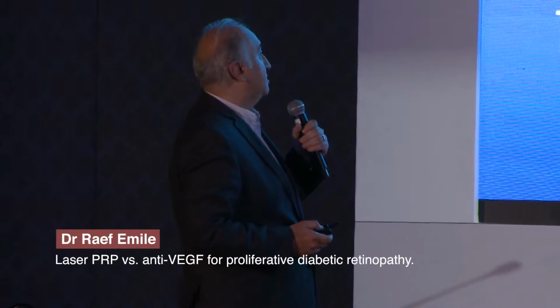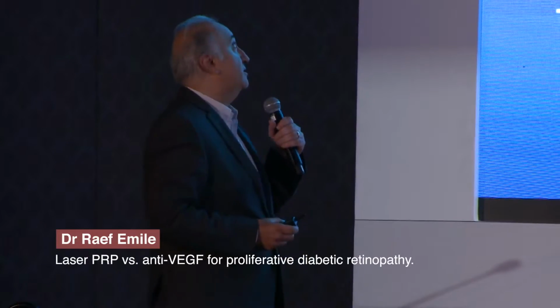But there are other options that we should know about, which is targeted PRP, targeted peripheral PRP, and anti-VEGF, as well as subthreshold micropulse peripheral PRP. So the standard of care has always been the full scatter pan-retinal photocoagulation since its introduction in 1959 in ophthalmology.